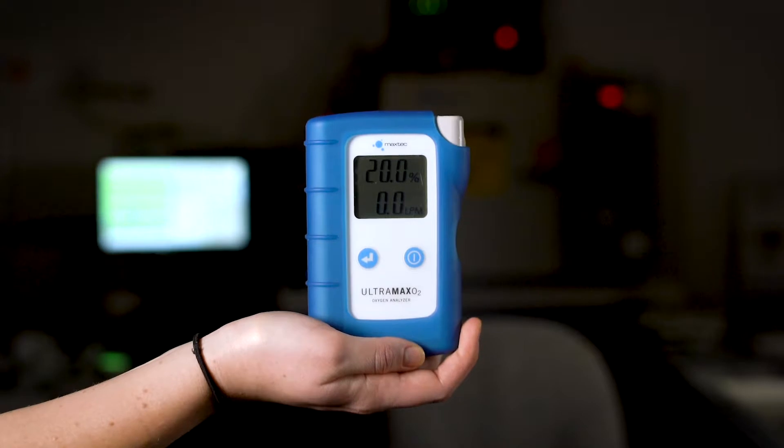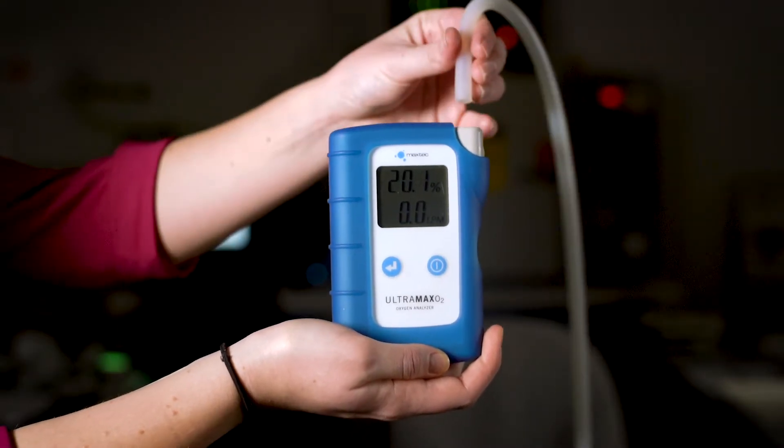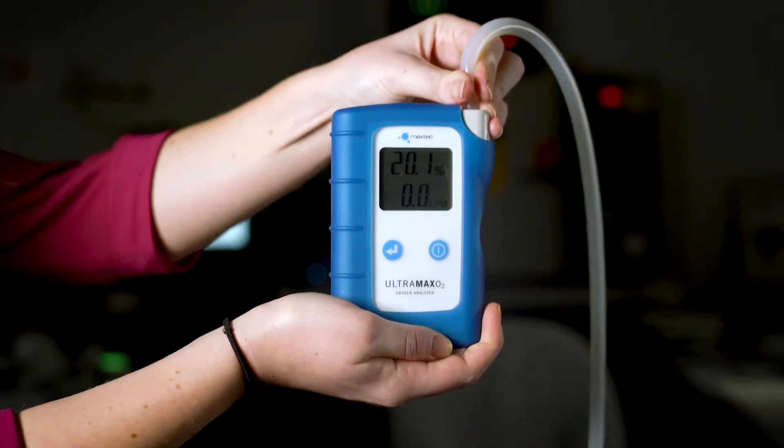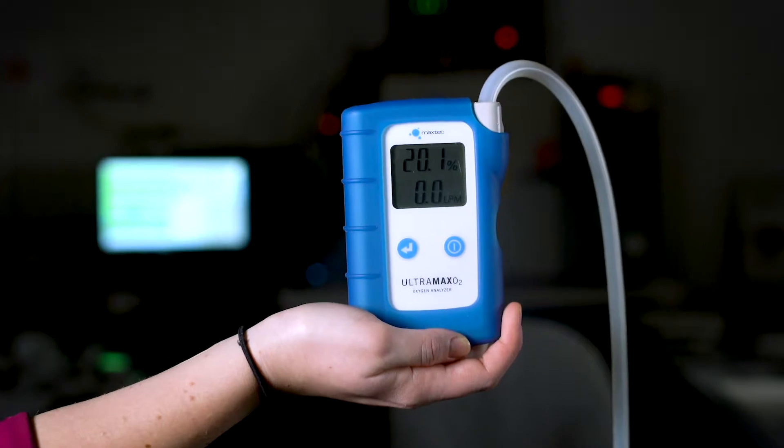To check the performance of your oxygen concentrator, simply attach the Ultramax O2 gas inlet port to the outlet port on a concentrator. The LCD display clearly shows the oxygen level and flow measurement.